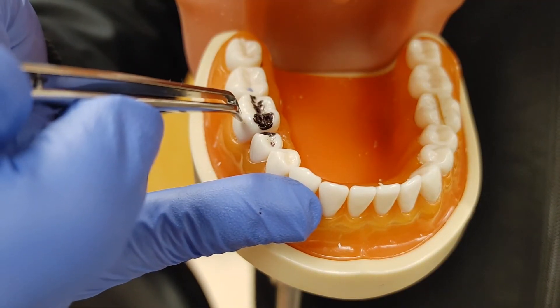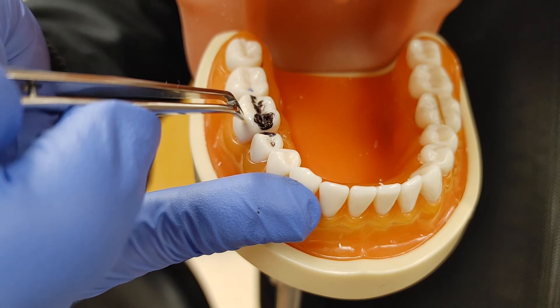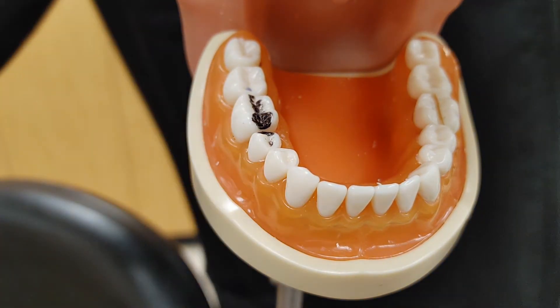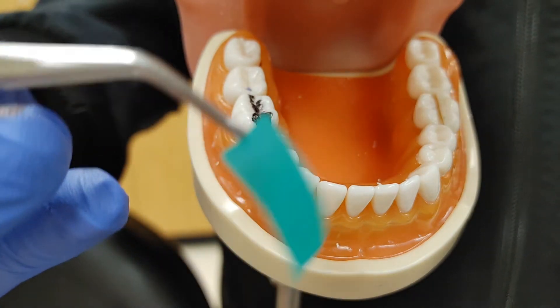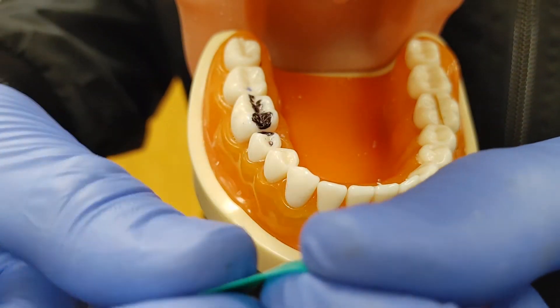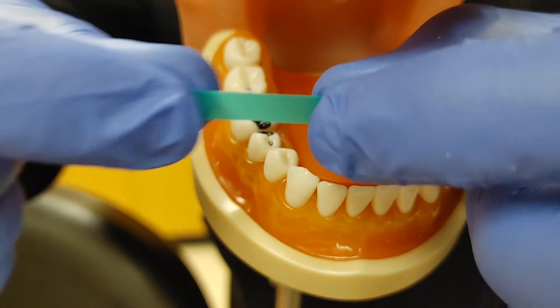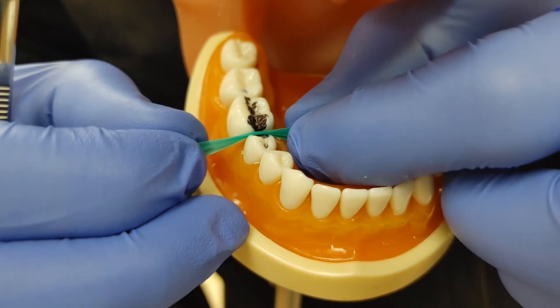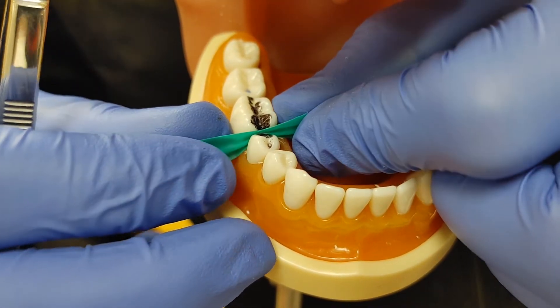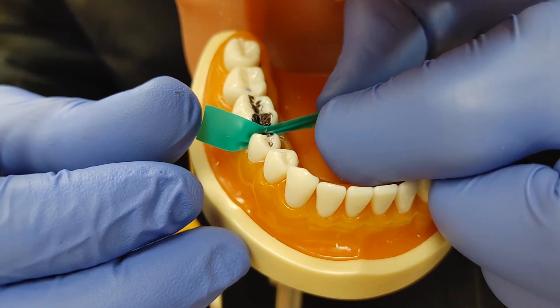In some cases when doing the electric pulp test, you might have two teeth right next to each other that have amalgam fillings touching in between. At that point, we need to insulate that tooth from shocking the one next door. Using a small slip of rubber dam material, floss it in between the teeth so it creates a nice barrier wall that will not deliver a shock to its neighboring tooth.